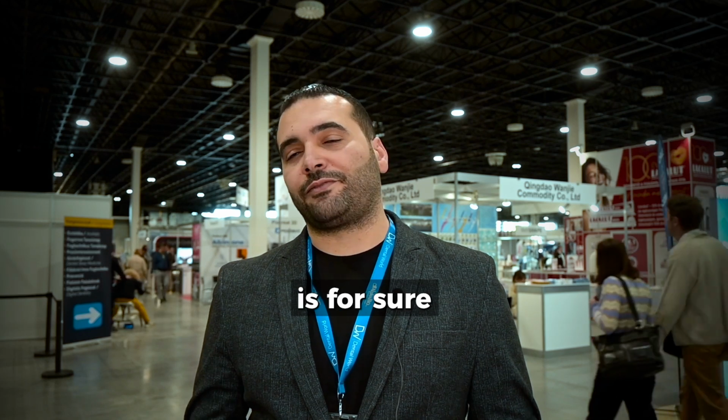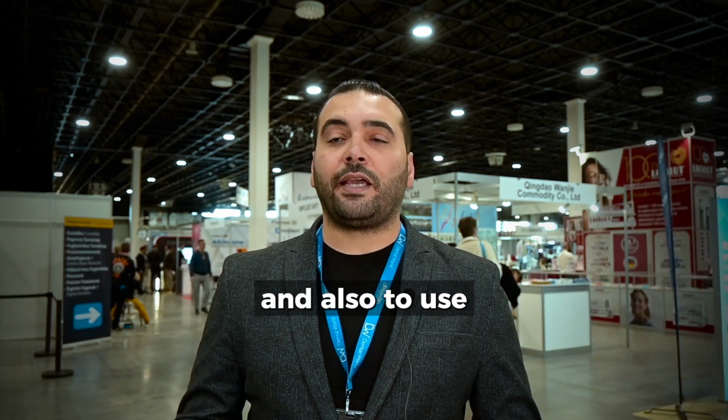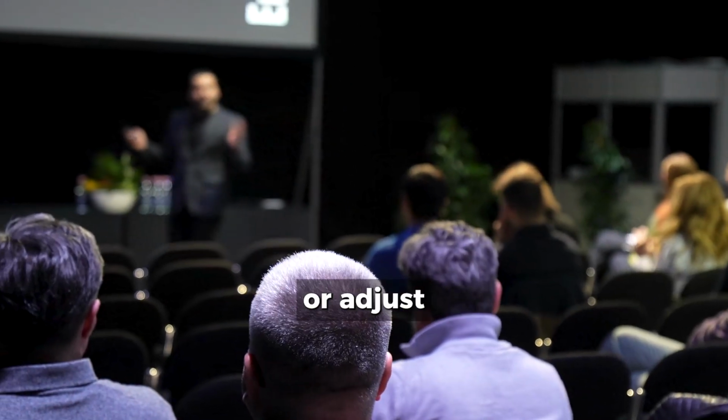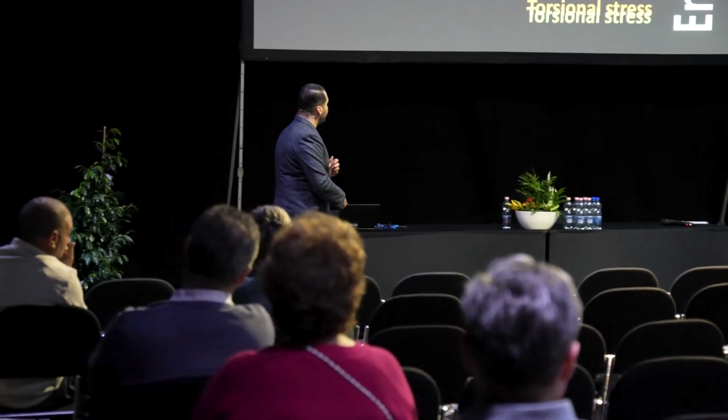In your experience, what are the most common causes of file separation, and what preventative strategies can clinicians implement to minimize the risk? Single use of the files is, for sure, very important, and also using the right sequence, the right instruments, and adjusting the right parameters for usage.